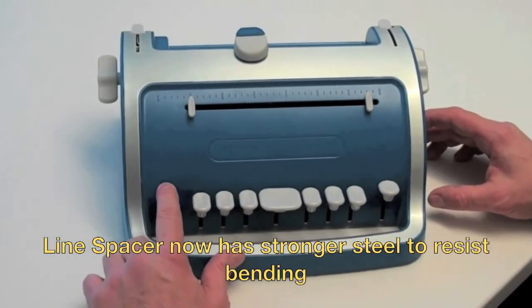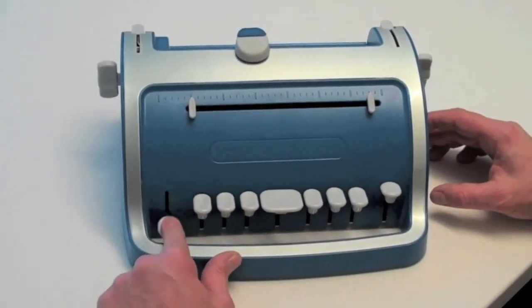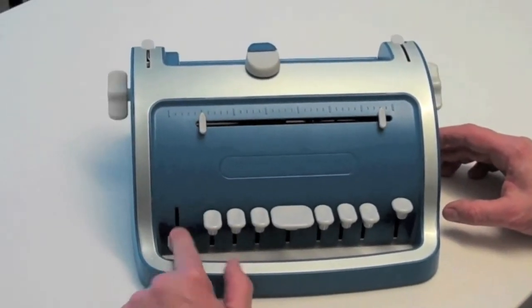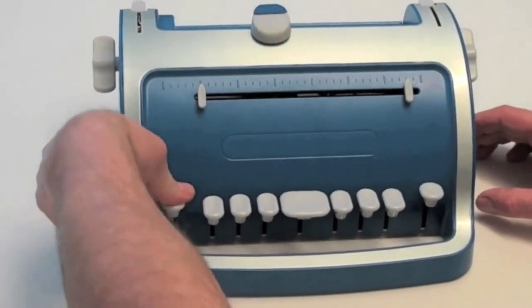Okay, the line space mechanism has been made of a much stronger steel. So when you get to the end, it will not bend. As you can see, it is quite strong.